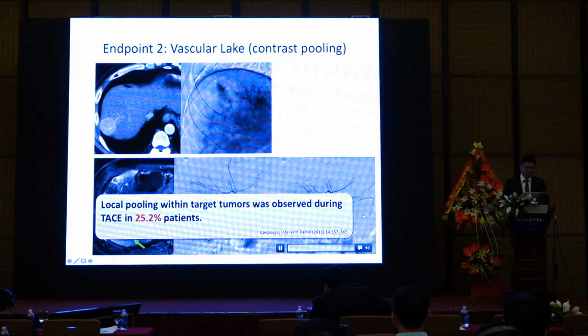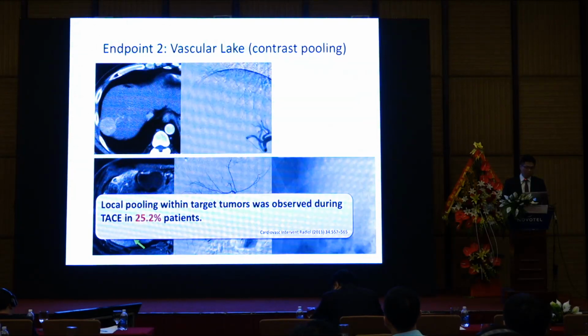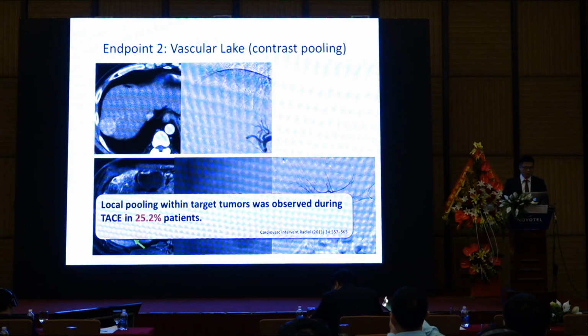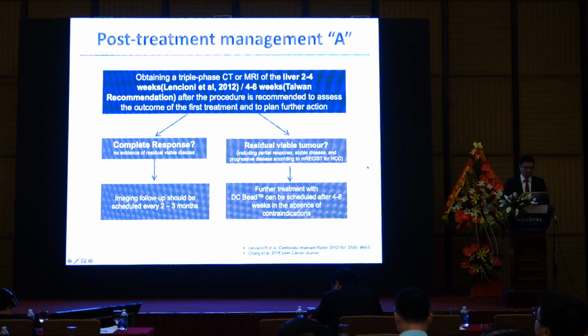And the contrast pooling vascular lake is usually seen in the hypervascular tumor, and the percentage can be nearly 25%. So how about the post-treatment management? If there is a complete response, we recommend imaging follow-up. However, if there is a residual viable tumor, further treatment is necessary.